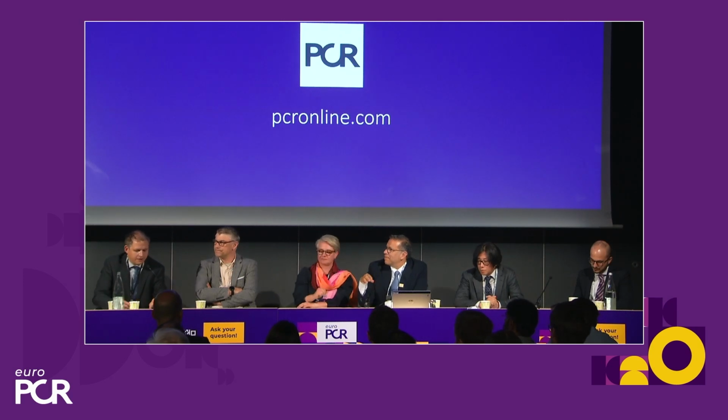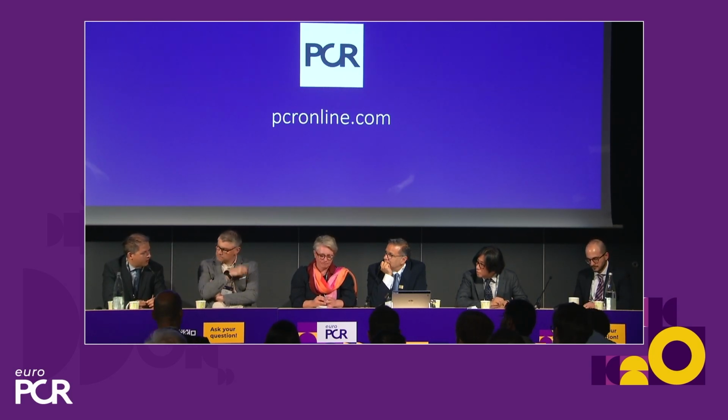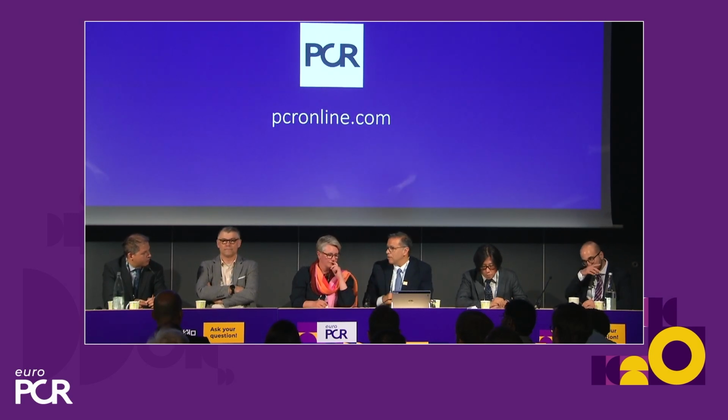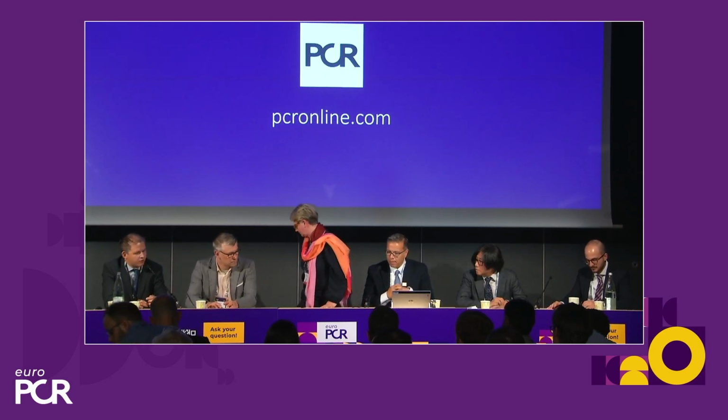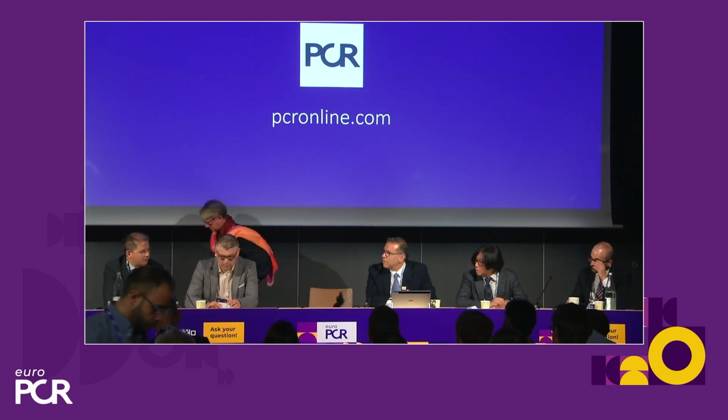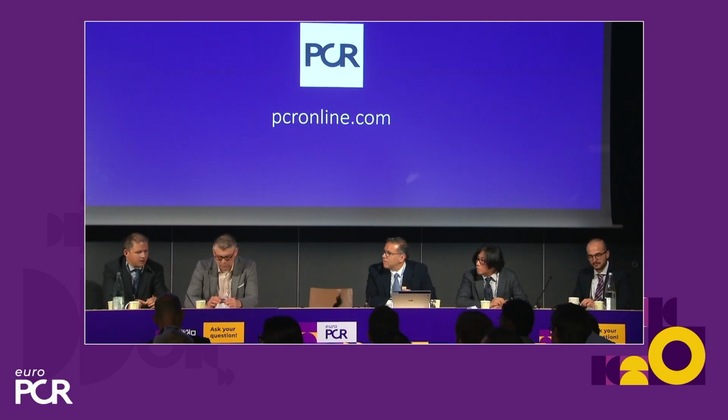Yeah, I think that in such a setting it could be very, very useful. While we were starting to use resorbable technology, we preferred using almost 100% imaging because we really wanted to implant the scaffold at its best. Now we have more practice, we know the technology better, but we still need some guidance. So QFR could be the perfect guidance to help us in the correct sizing. Maybe if you need the morphology information at this moment, you need to perform IVUS or OCT.